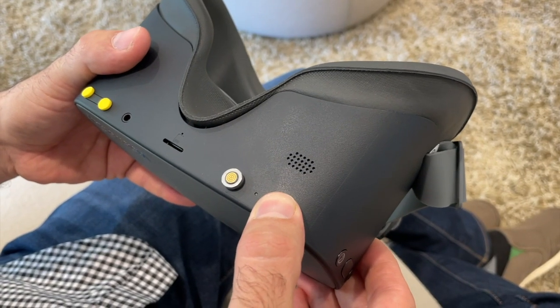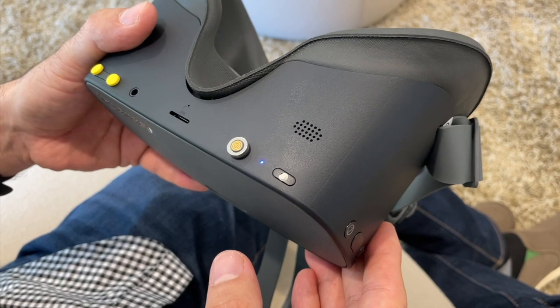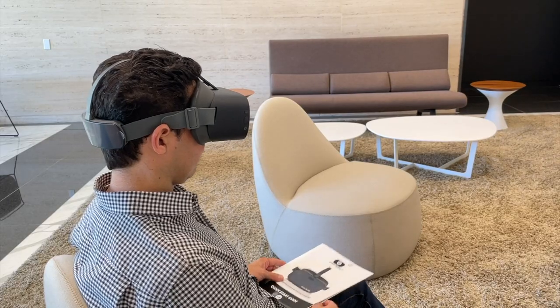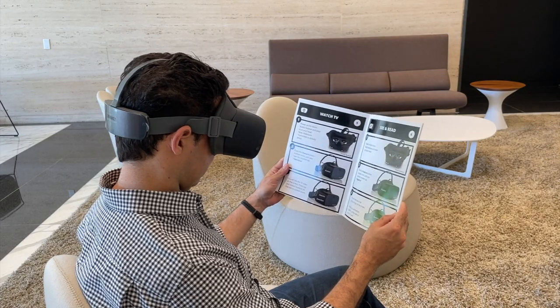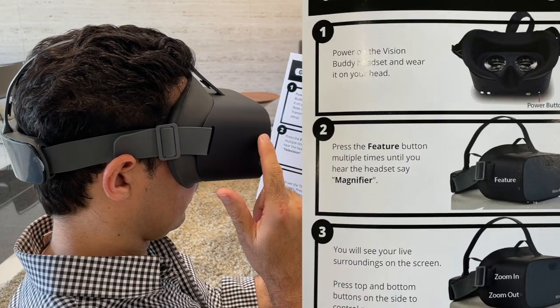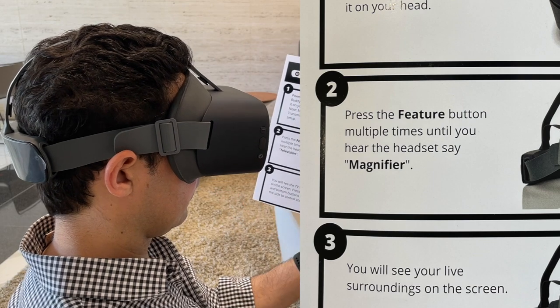First, make sure to power on your Vision Buddy headset by holding down the power button until the blue light comes on. Once the headset is turned on, make sure to cycle through the modes until you are in magnifier mode. In magnifier mode, you are now able to zoom in and out using the headset's built-in camera.